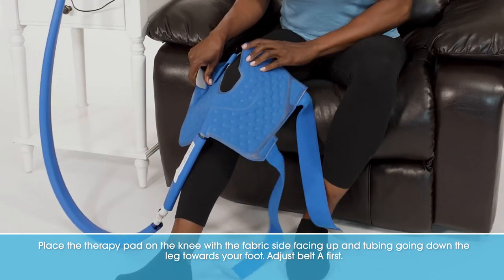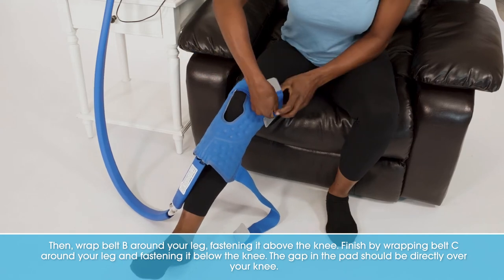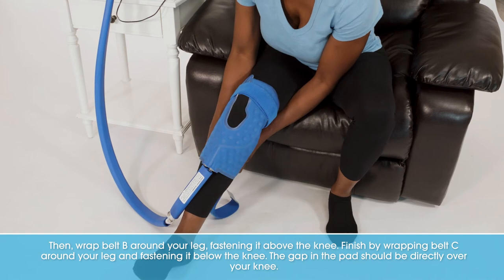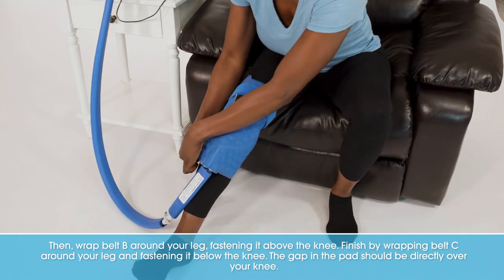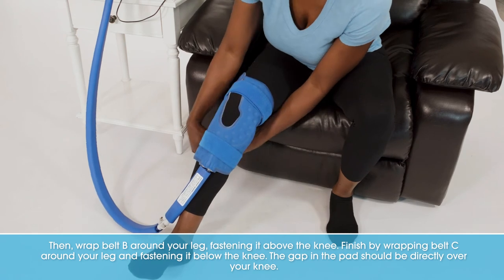Adjust belt A first. Then wrap belt B around your leg, fastening it above the knee. Finish by wrapping belt C around your leg and fastening it below the knee. The gap in the pad should be directly over your knee.